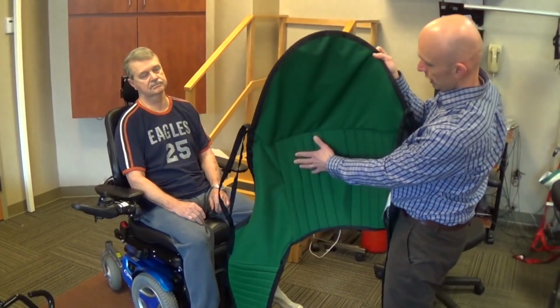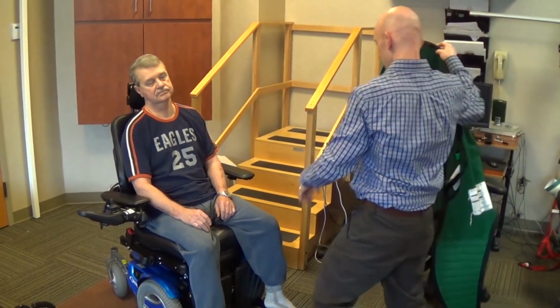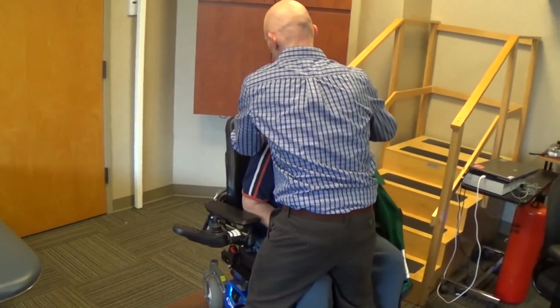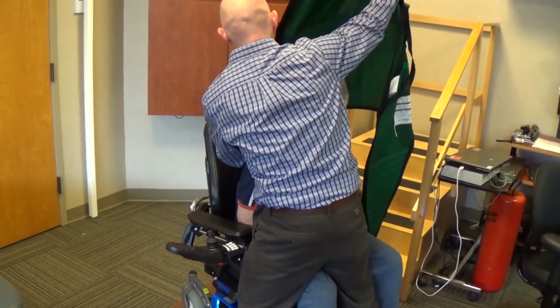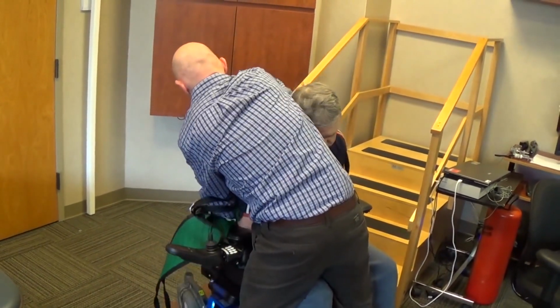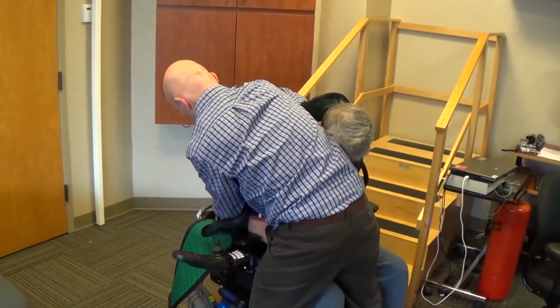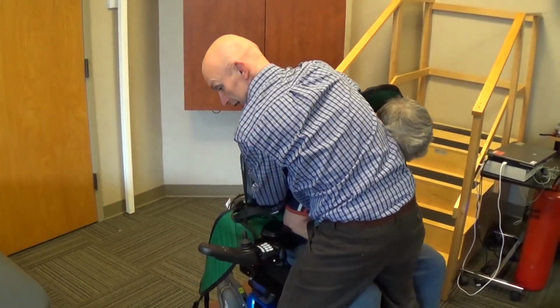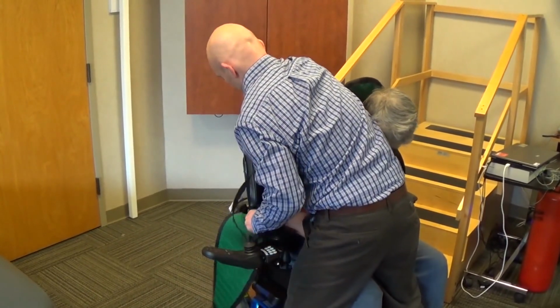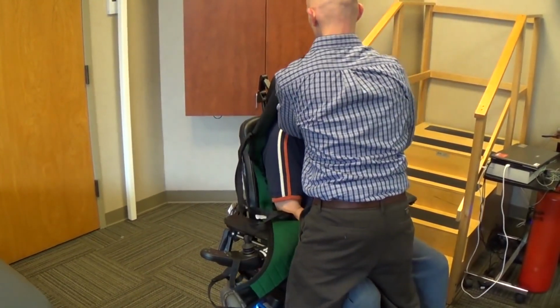I'm going to put the sling in with the handle on the outside or the back. I'm going to help the person lean forward, staying close to your body, and then sliding the sling back behind them. You want the bottom part of the sling close to the person's pelvis, so sliding down low towards the cushion, and then helping the person rest back on the seat, and then helping them get their head back.